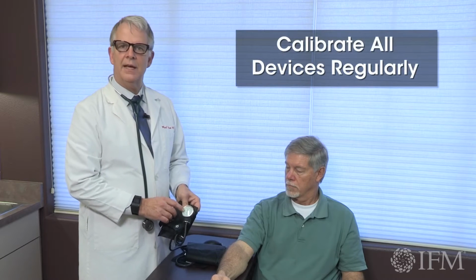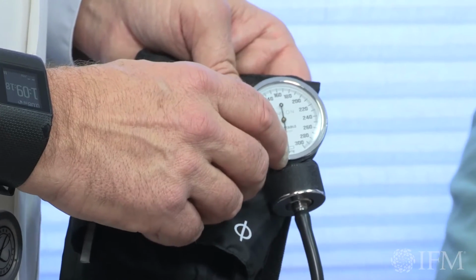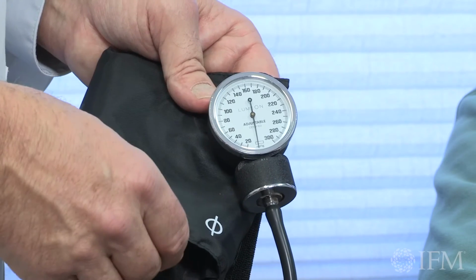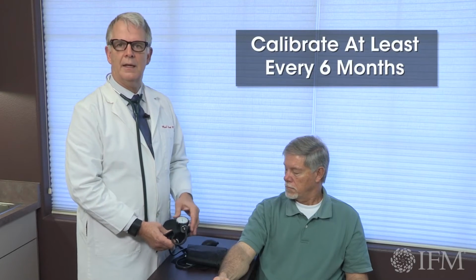The manual cuffs, also the aneroid cuff, is one we're used to. The challenge with the aneroid cuff is it ages. And the little bellows, the metal plate inside, ages and fatigues. And so with the aneroid dial, you want to make sure it doesn't have an automatic stop. If it has an automatic stop, then you don't know if it goes past zero, negative, and so you'll have inaccuracies. These do not have automatic stops, and so it's useful. They should be calibrated at least every 6 months.